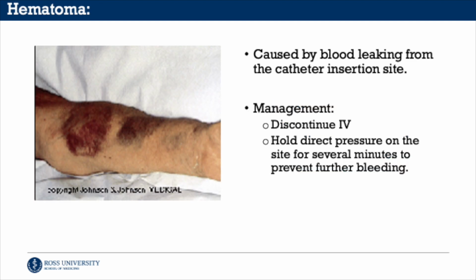There are, however, a few possible complications which could arise, which you need to be aware of. A hematoma caused by the blood leaking from the catheter insertion site. Management of this would include discontinuing the IV and holding direct pressure on the site for several minutes to prevent further bleeding.